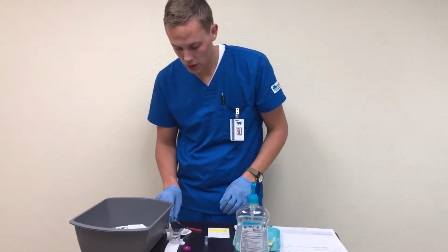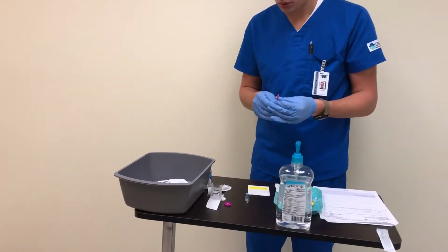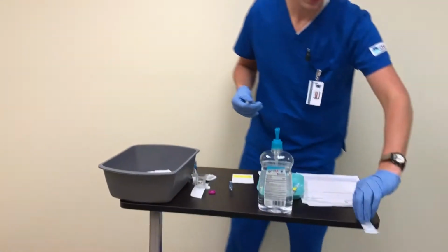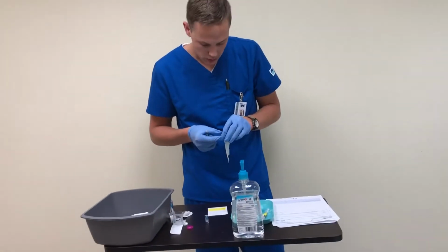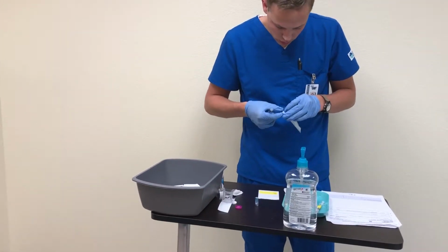So then I'm going to do the safety sweep and get the needle tip cover back on. And I will be disposing of that needle as well as that later. And then I'll just be putting on this 21 gauge needle. If I can get my hands to open it.